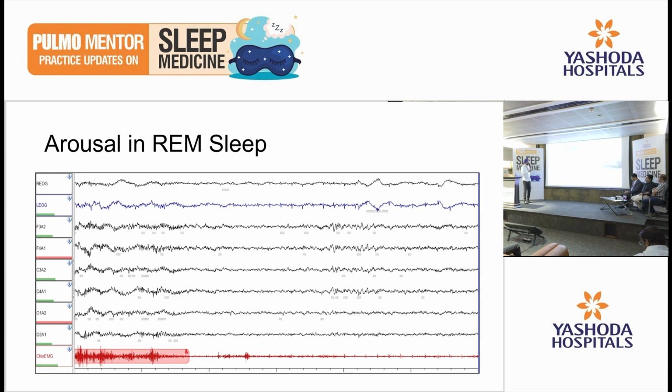Now, the American Academy of Sleep Medicine recently updated the scoring manual. So in 2023, version 3 has been published. One big confusion regarding arousal scoring used to be, if let's say the previous epoch is N1, I enter this epoch, and this arousal is lasting for 15 seconds or more, what do I do with that?